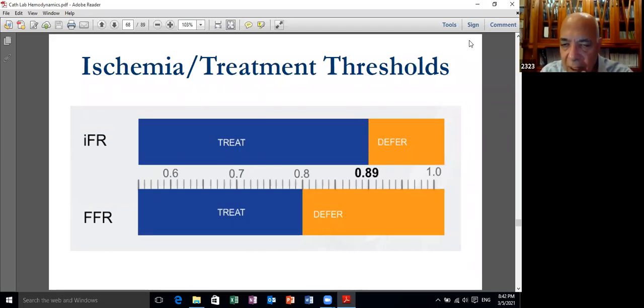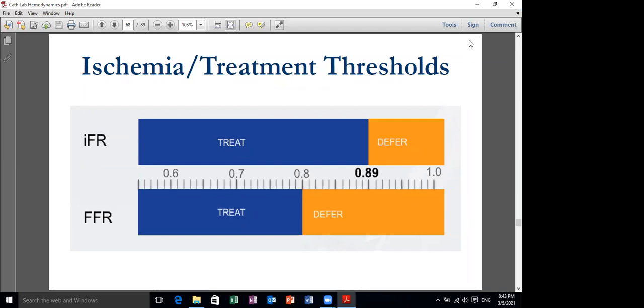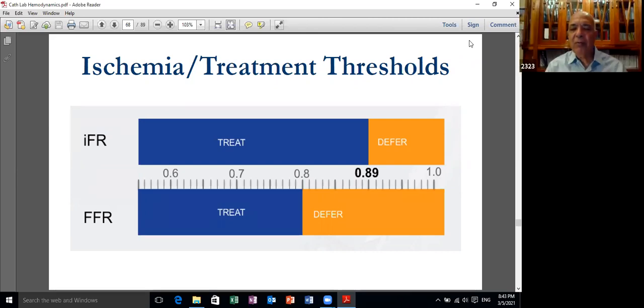You have to make other measurements. So we don't use the FFR. Usually we don't take the patient with severe heart failure to the cardiac cath except in the primary setting. Otherwise, we usually settle the patient; if he has heart failure we treat him and then we use the FFR in the cath lab if it is available.